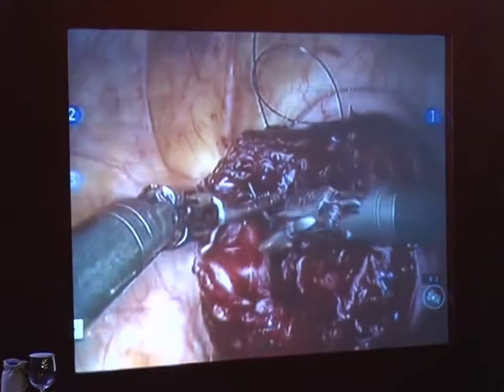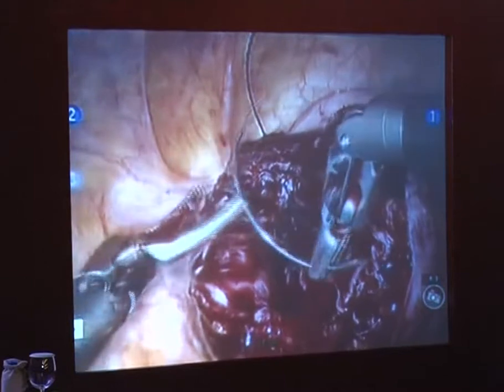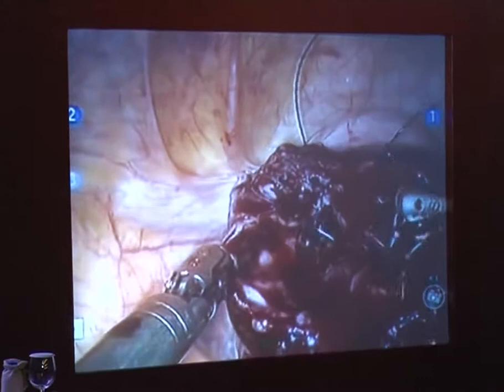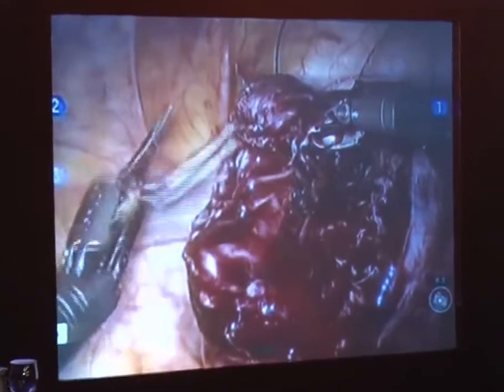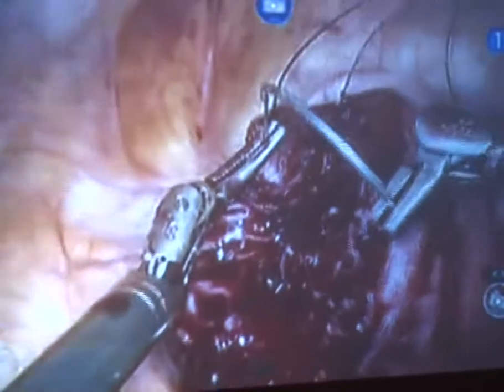The other thing you have to remember too as we're doing this is that's the endometrial cavity right here. I don't want to take too aggressive of a bite and sew my manipulator into my defect, which is easy to do if you're not paying attention. So you want to make sure that as you get your bites, you get good bites, but you're not sewing your manipulator into the incision.